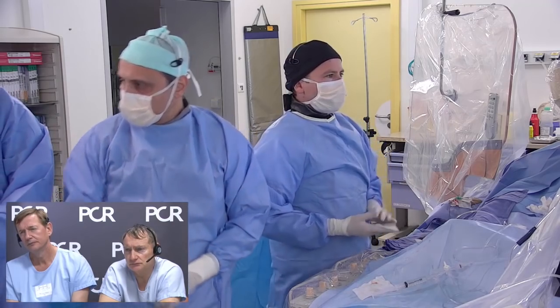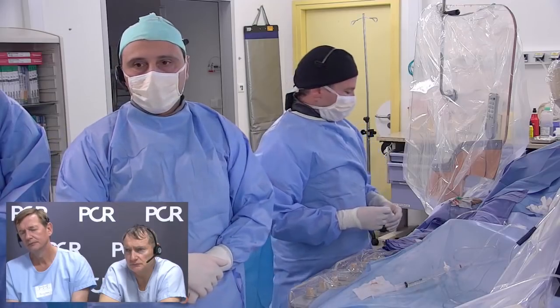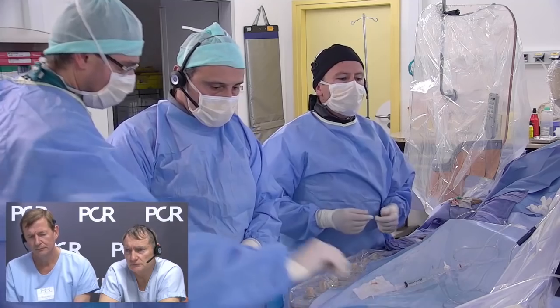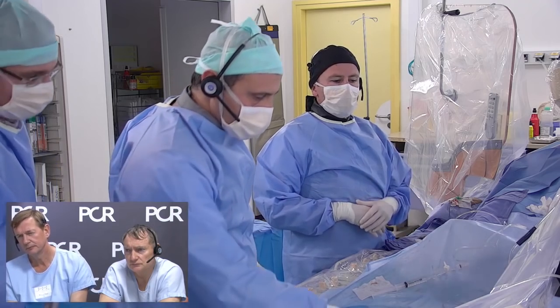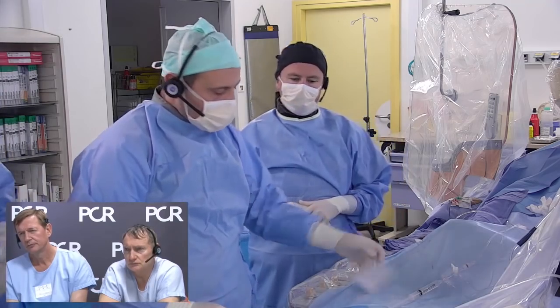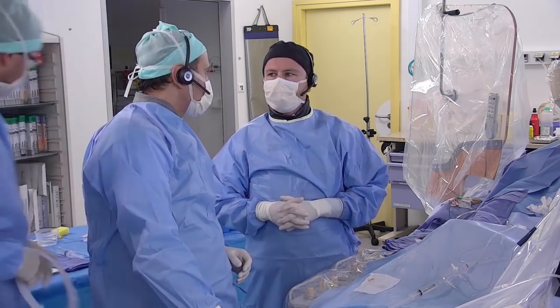For this lesion I don't think I need it, but if I had failed to advance it, our option would have been to use a microcatheter, or even a small over-the-wire balloon, to exchange the workhorse wire with the ROTAWire. Nicolas, I think now we need to decide on our rotablation strategy, and first of all, we need to decide on the burr size.